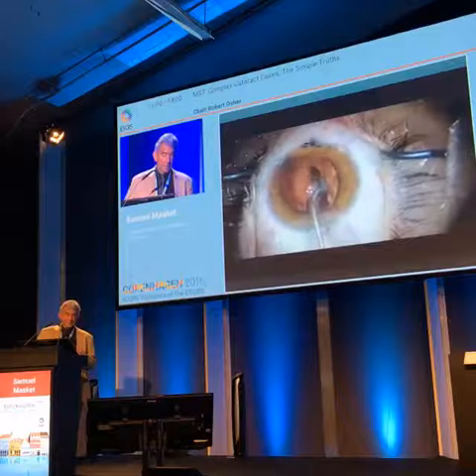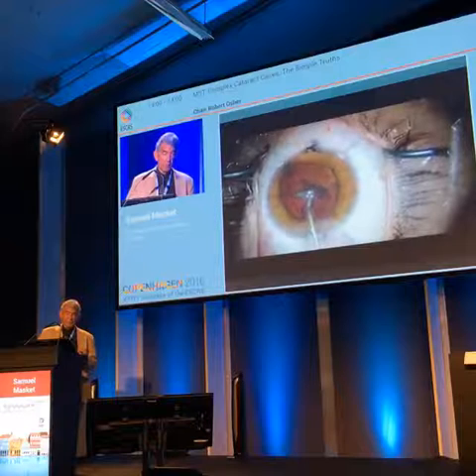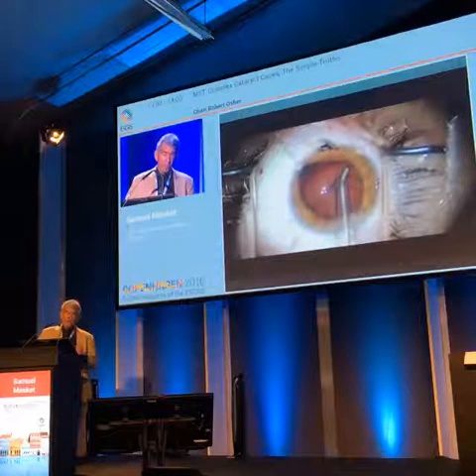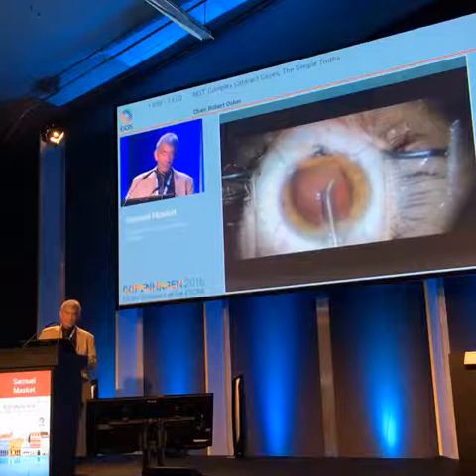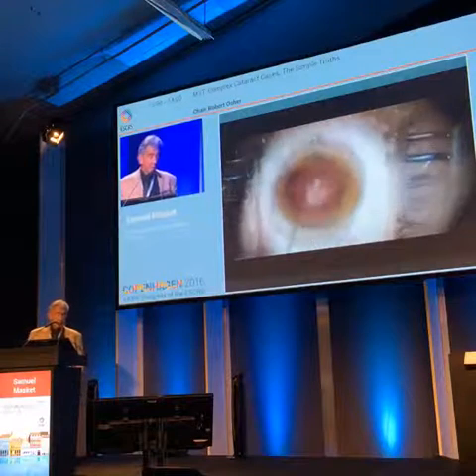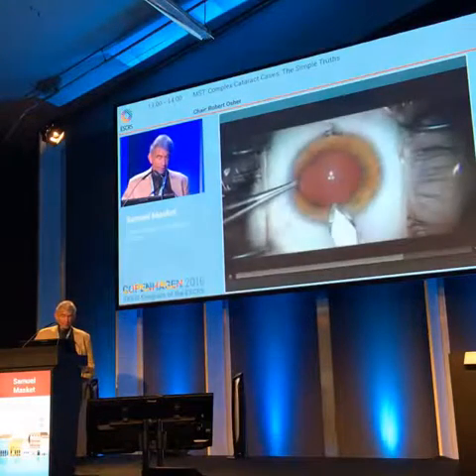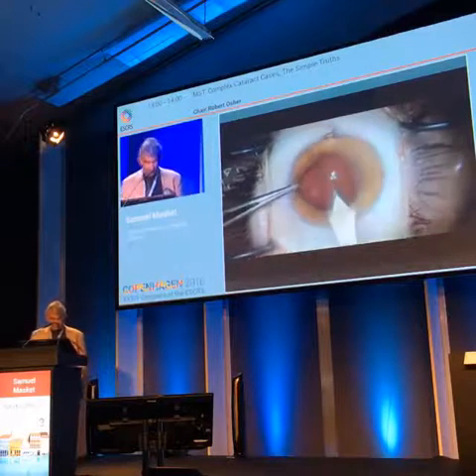Now, as it turns out in this case, the capsule was intact and life was good, and all these maneuvers weren't necessary. However, the capsules, remember, can be as thin as 3 microns or even less, and so I always practice this technique in anyone with a posterior polar capsule, even if I don't suspect a defect or pre-existing defect in the capsule. And I don't polish the posterior capsule. Here we're just setting the patient up for intraoperative aberrometry, after which we'll place the intraocular lens. I think we can move on from here.